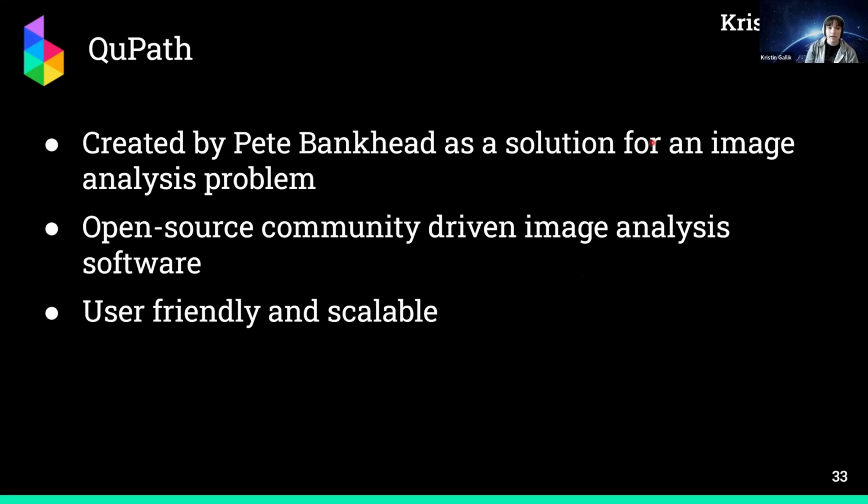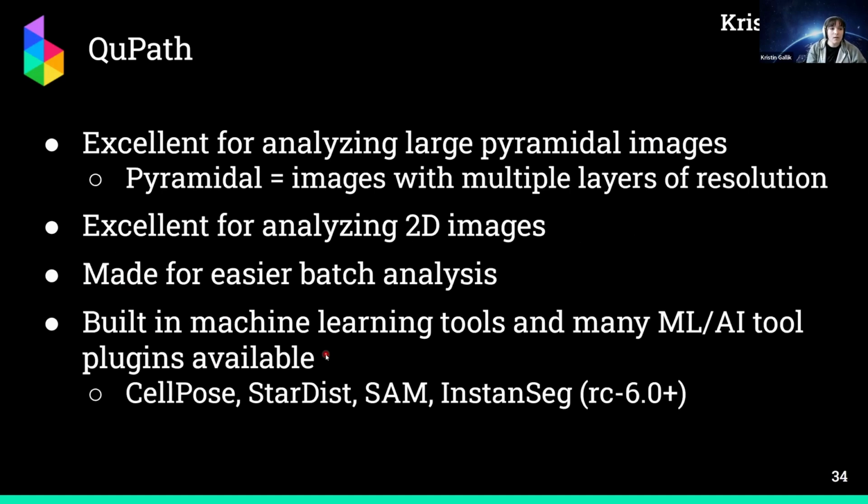It was created by Peter Bankhead as a solution that he came up with for an image analysis problem he was experiencing. It is open source, community driven, and it is pretty user friendly as well as scalable. It's really amazing for analyzing those large pyramidal images. So these are images that you might get off of a slide scanner where you have multiple layers of resolution. They're very, very large tissue samples. It's really great at handling those.